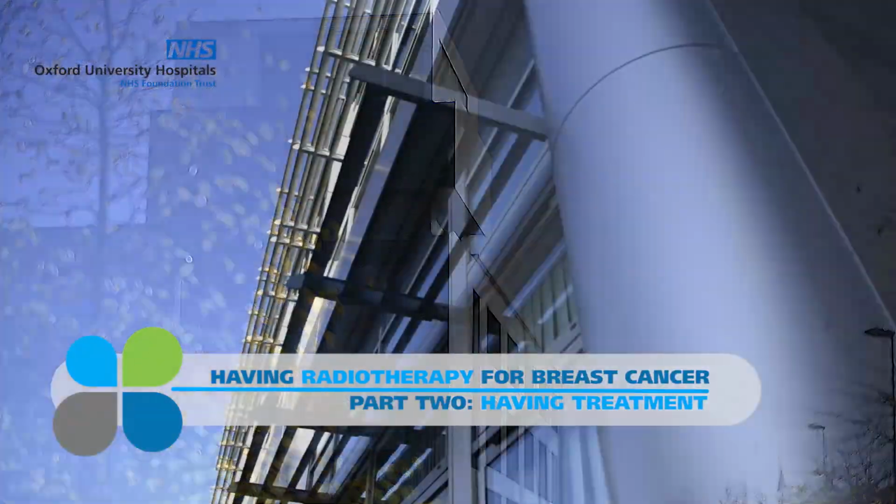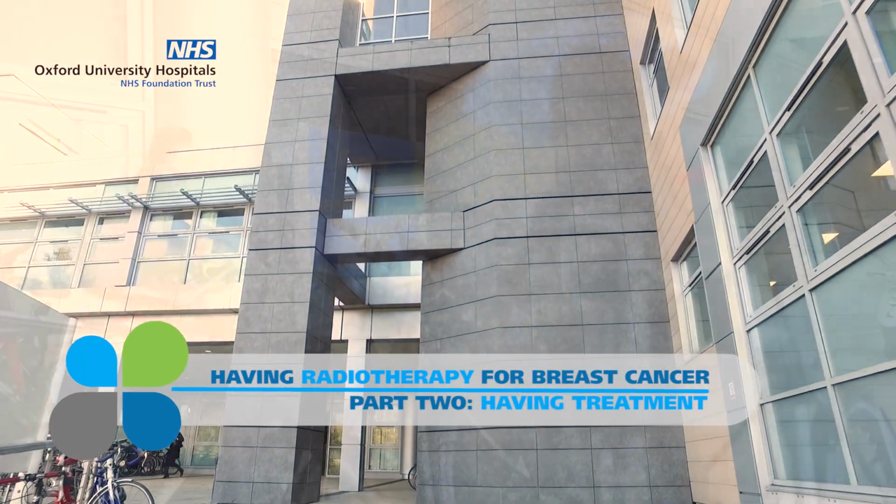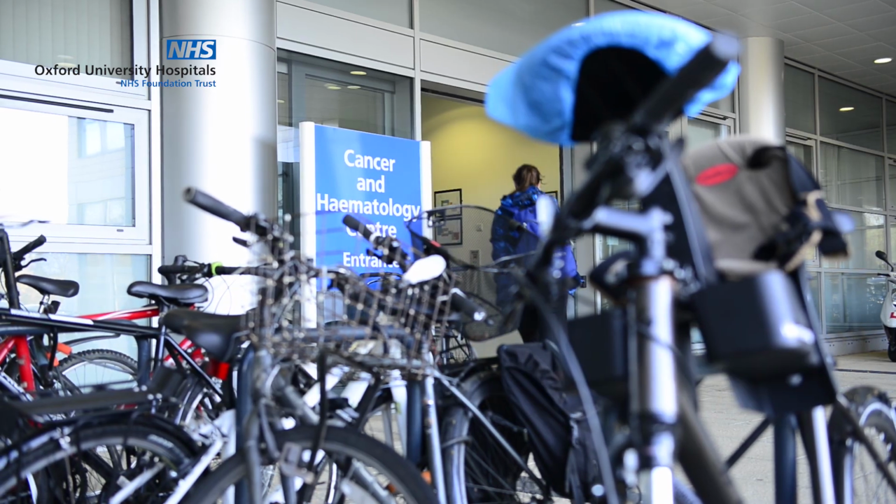Your consultant will decide what type of radiotherapy you'll be receiving. Depending on whether or not you've had surgery, you'll be having your breast and potentially your nodes treated, or if you've had surgery, your chest wall and also potentially your nodes. Then, depending on which side we're treating, we will also be treating you within a deep inspirational breath hold, which will require you to take a deep breath while we're treating you.